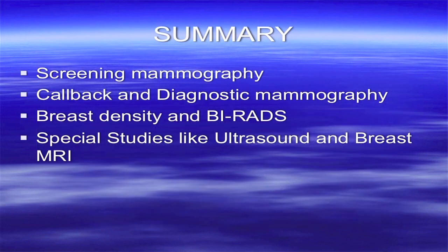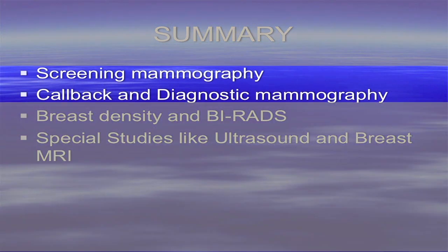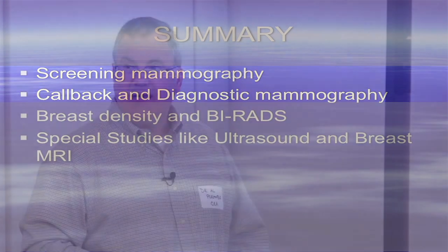And summary, here we go. Screening mammography we talked about applies to essentially all women that have breasts 40 and over. Callback and diagnostic mammography: callback if you had an abnormal screening, diagnostic if there's a reason to look at the breast more intently. Family history, pain, palpable abnormality, nipple discharge, something wrong with that breast.